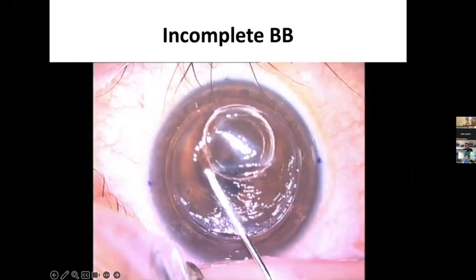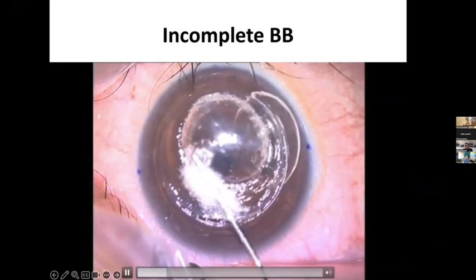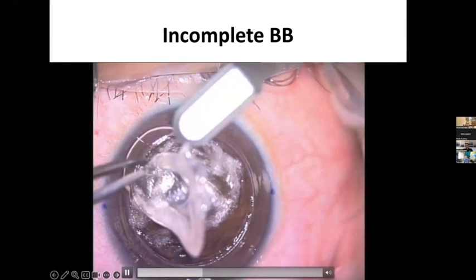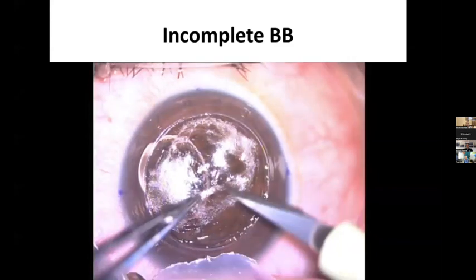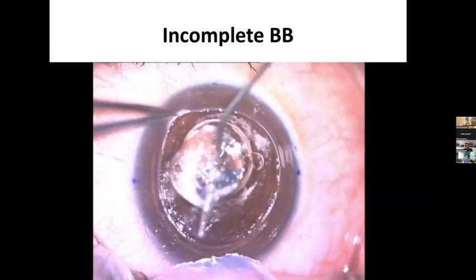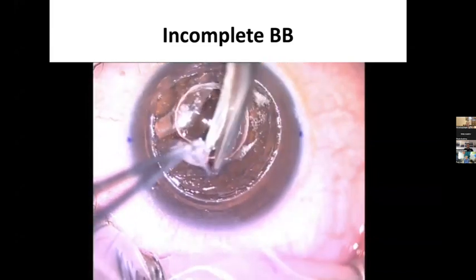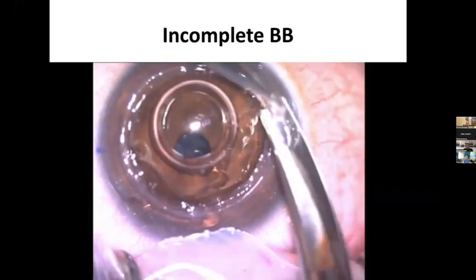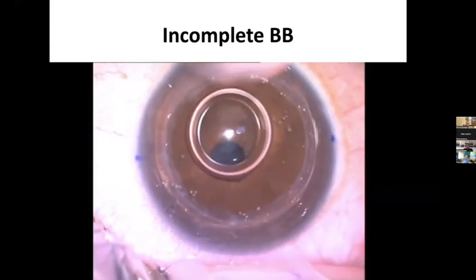So I am injecting now, and I find resistance to the increase in the size of the bubble. If you find that a small bubble is formed, do not increase the force of injection, and do not try to increase the size of the bubble. The bubble did its job, which was to open the plane between the predescemetic layer and the stroma, which is our target plane, and you can continue the dissection of the remaining part manually. I'm stressing: do not try to increase the force of injection or the size of the bubble.